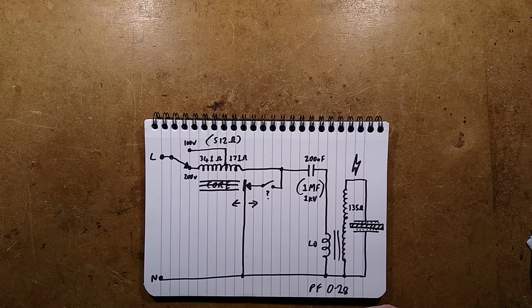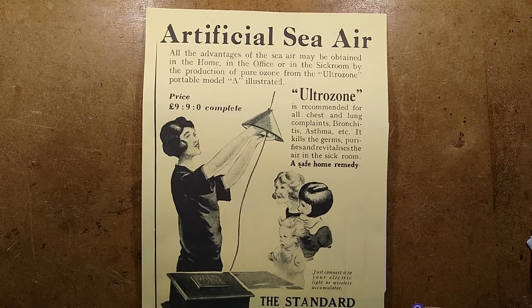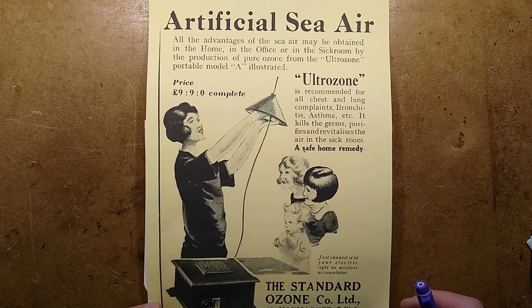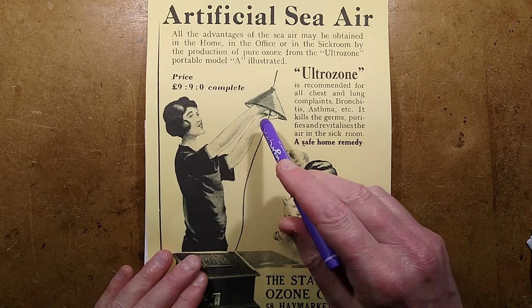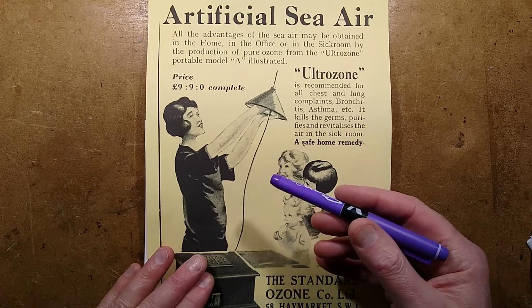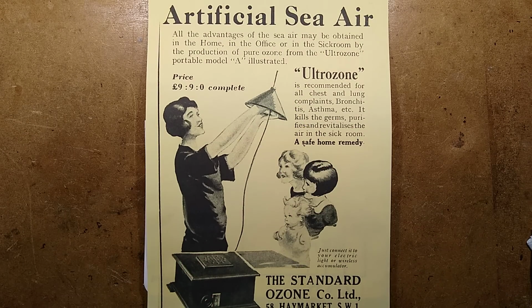It's very attractive. The advertising is even of that era, with the mama stuffing her hand into the lamp holder there while the small children wait in anticipation of being cured of their diseases with electricity. Just connect it to your electric light or wireless accumulator. The reason they were connected into the light is that's how they connected things back then. There were no real sockets. They just plugged everything into the lamp holder. That's the era of the electricity. But that is it. The standard ozone, ultrazone, vintage, 100-year-old medical unit.